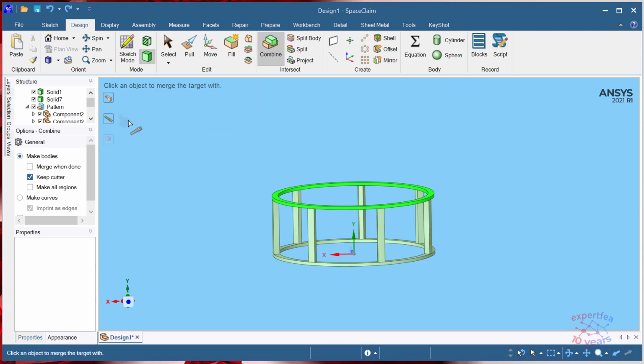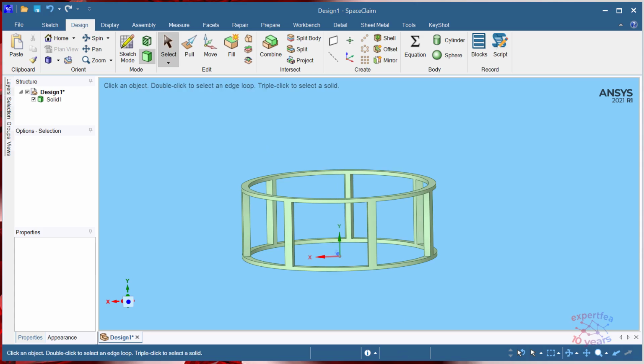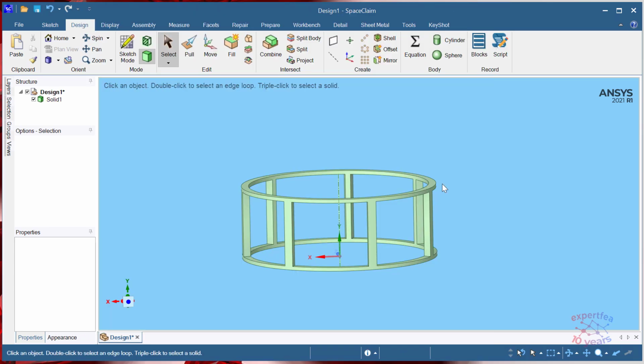We will click the select bodies to merge, then one by one, slowly with ease, we'll click all the objects needed. So even you can see here these are empty, so we can delete here and we're left with only one portion. So 12 millimeter will mean maybe around 60 instances or something like this.